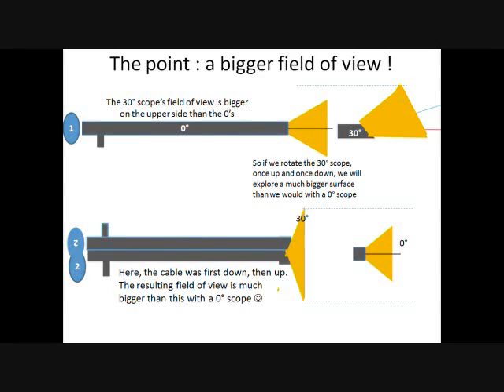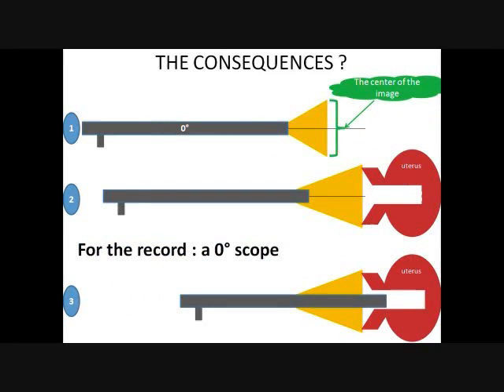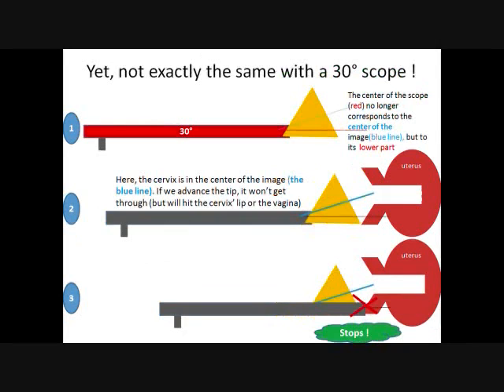Yet the problem is that, like a 0 degree scope, which makes the center of the image in the way of the scope, a 30 degree scope puts the center of the image 30 degrees upwards, if the light cable is downwards, of course, like we work here. And this means that if we put the cervix in the center of the picture, it won't be in the way of the scope. So if we put it in the center and advance, the tip of the scope won't get through it, but it will just hit the cervix lip or the vagina. So what do we do?